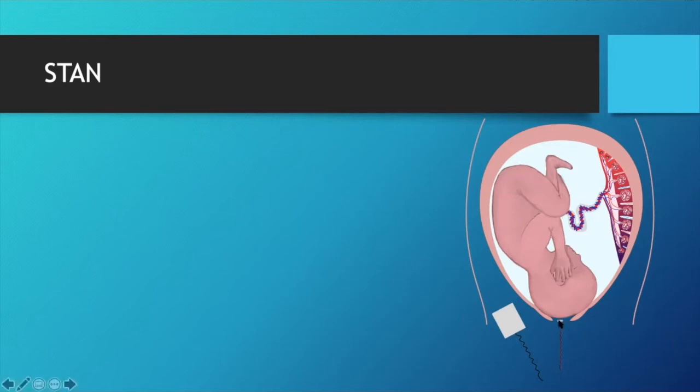If this is actually touching the maternal cervix or vagina, it may interfere with the signal, which is why with babies that have a very low head, we go in and try and put an FSE and yet there's no impulse. Those that are just at 1 centimeter cervix, and you're trying to put it in, and the FSE cable is literally just squashed between the cervix and the head, you frequently get very little signal. Does that make sense?